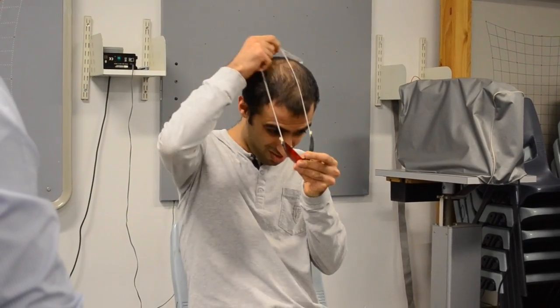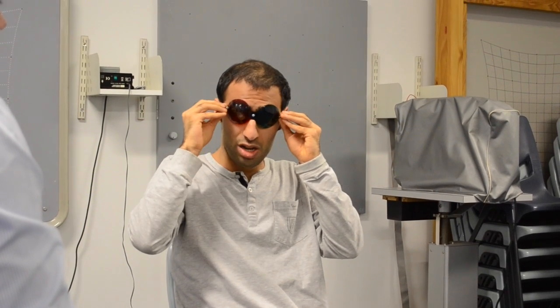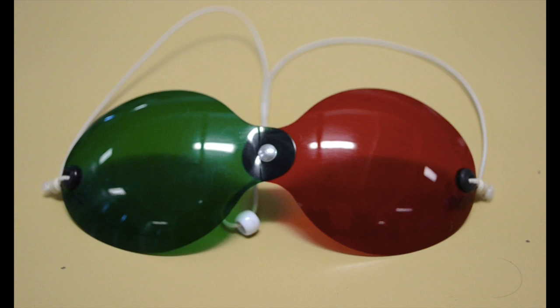Conventionally, the goggles are placed with the red filter in front of the patient's right eye and the green in front of the left. Consequently, the red filter will only allow red light to enter the right eye, and the green filter will only allow admission of green light into the left. This then allows the clinician to interpret the findings and easily relate them specifically to either eye.